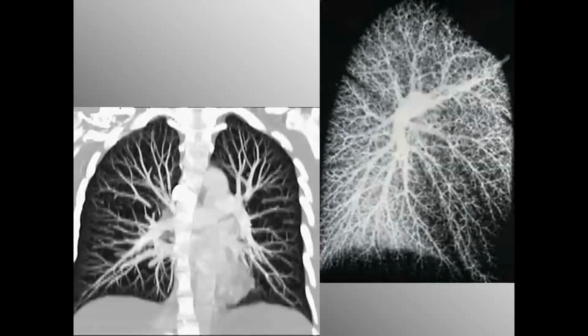The bottom left here represents the lung's extensive major vasculature, and the upper right pictured is what we affectionately call the tracheobronchial tree. All the repeatedly bifurcating airways that create issues for those in pulmonary medicine, the good TB tree, right? We're just building better perspective here today. Do recall that the vasculature traces the bronchial tree. It's almost a 1-to-1 ratio. Now, there are certain vessels that are feeding the structure itself and providing nourishment to the actual tissue. And then other blood flow, of course, is supplying the alveolar capillary interface where gas exchange is actually occurring.